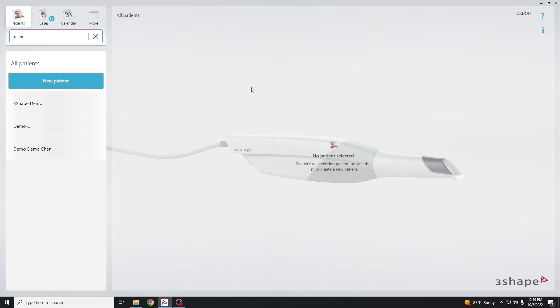Alright, so in this video we're going to show you how to make a printable model after you've done an internal scan.